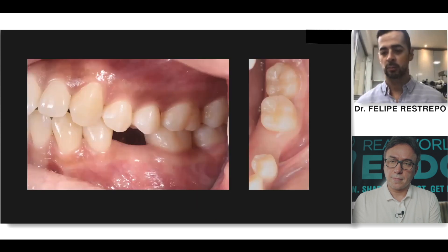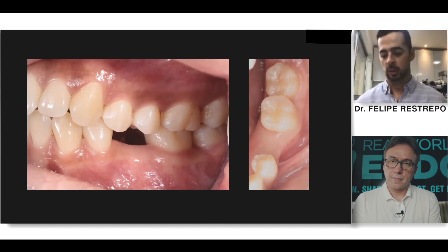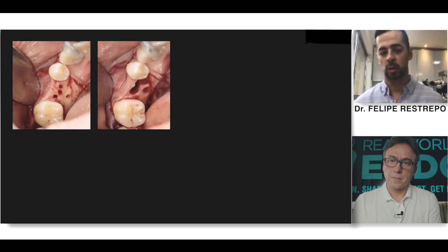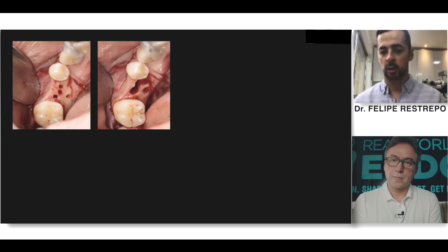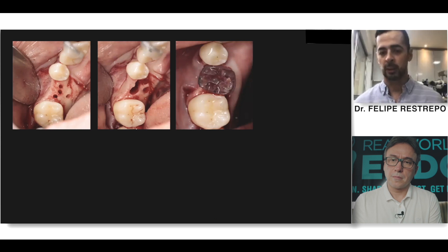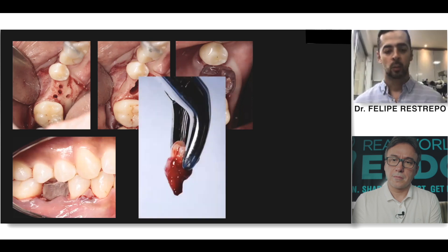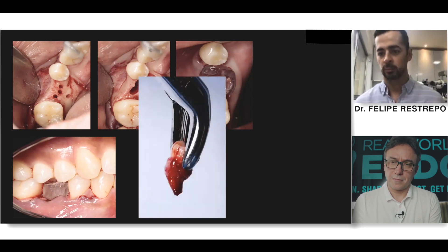This is the clinical situation. As you can see, there is enough space and a little loss of bone on the buccal side because of the lack of the premolar. We start drilling and enlarge those implant sites until they fuse together into one big socket. Now we place the 3D replica and start doing fitting attempts. Once we have it exactly in the position we want, we extract the donor tooth just then.